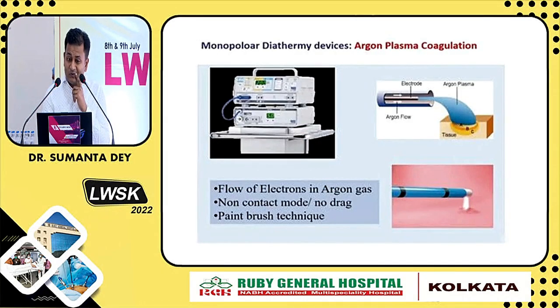Then there is another monopolar diathermy device, argon plasma coagulation, where between the electrode and the body there is an argon plasma source, and the generator delivers the electrons in a spray mode. If there is some bleeding from the liver surface, you can use it like a coloring spray method to coagulate the surface. Mostly argon plasma coagulation is for surface coagulation. Till now it is not much used in laparoscopic surgery, but slowly it will come up while doing liver resection by laparoscopy.